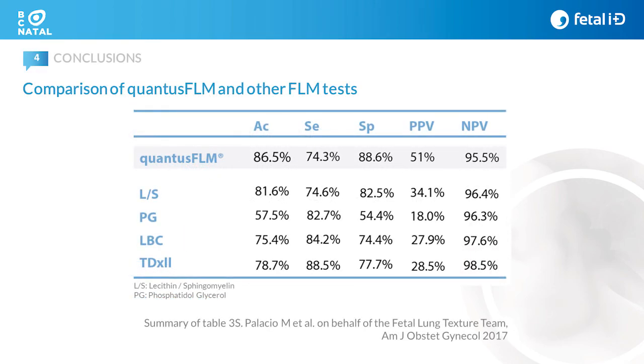Therefore, Quantus FLM predicted neonatal respiratory morbidity with an accuracy similar to that previously reported for other tests, with the advantage of being a non-invasive technique. This may help clinicians and patients in the decision-making process to plan delivery.